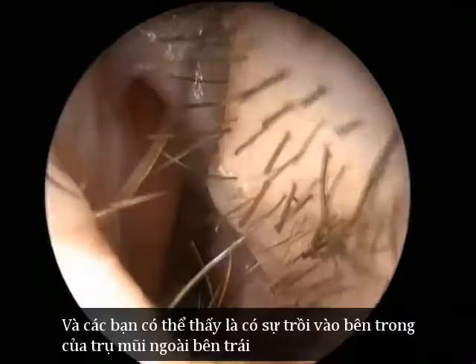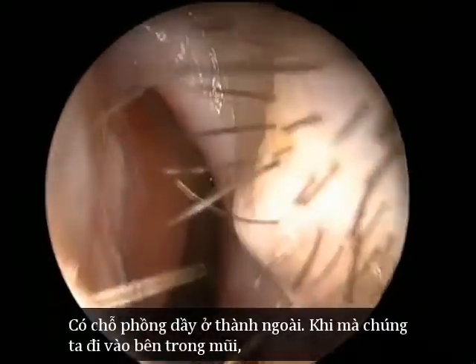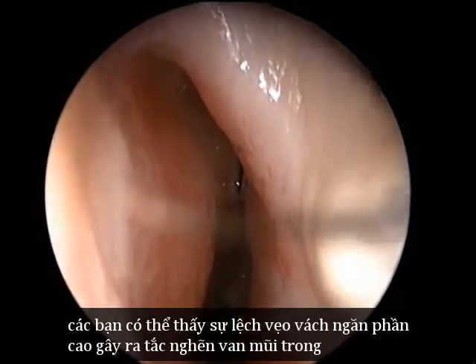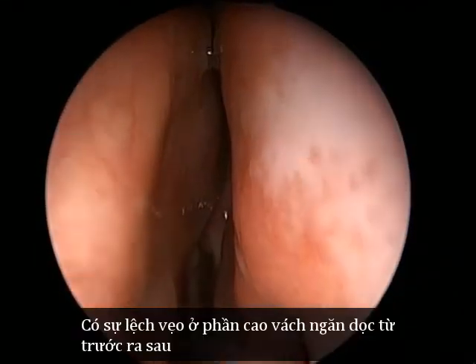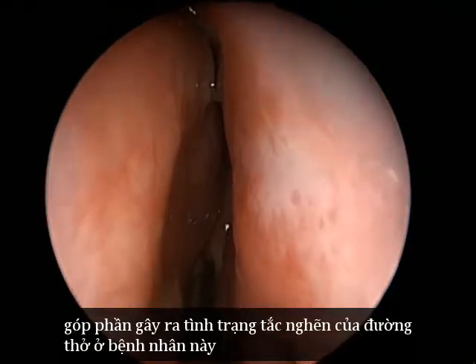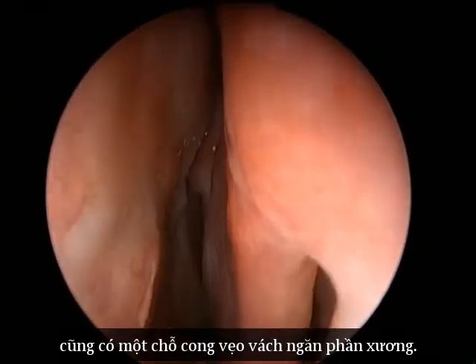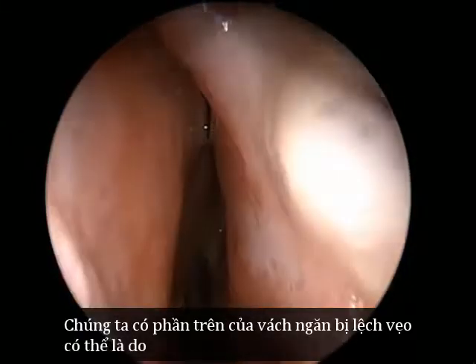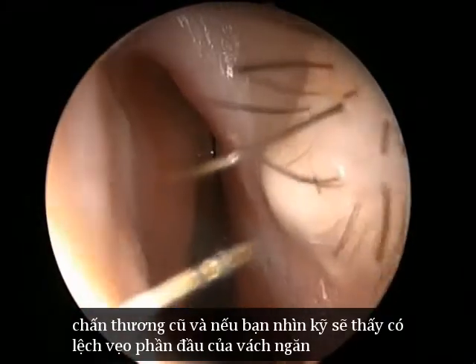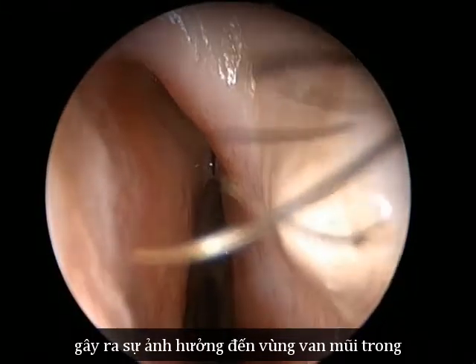We move into the left airway. You can see some degree of internal recurvature of the left lateral crus right there, that little bulge in the side wall. And as we move intranasally, you can see a high septal deviation blocking the left internal nasal valve. So there's a high septal deviation moving all the way back, which is creating some blockage of the upper aspect of his airway. The inferior aspect of the airway looks reasonable, and then he has a posterior bony deflection as well. So this upper aspect deviation is likely due to his injury. And then if you look caudally here, he also has a caudal septal deviation, which is also impinging in the region of the nasal valve.